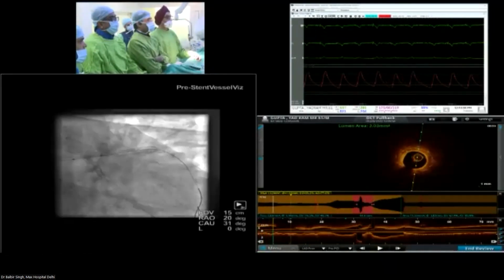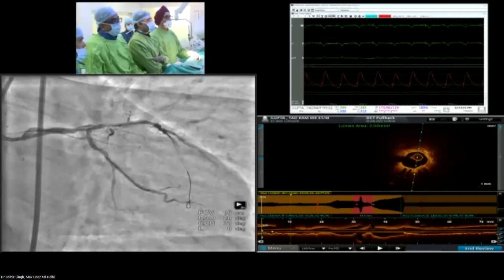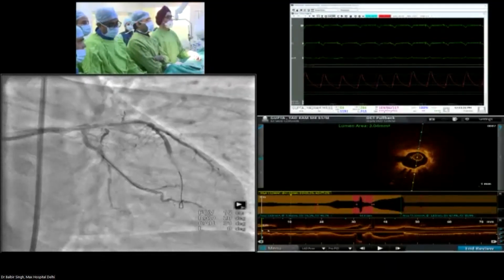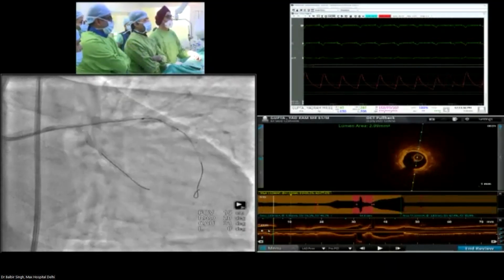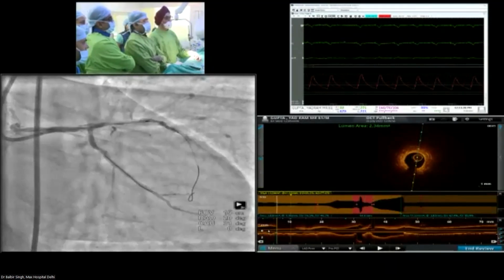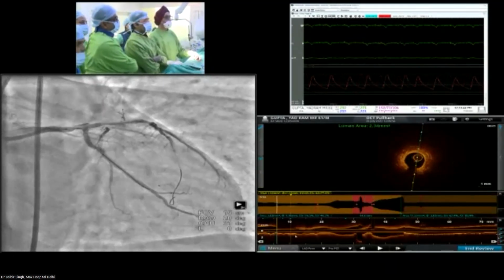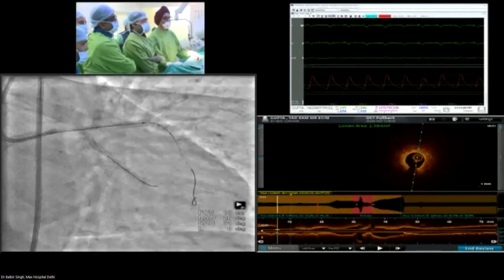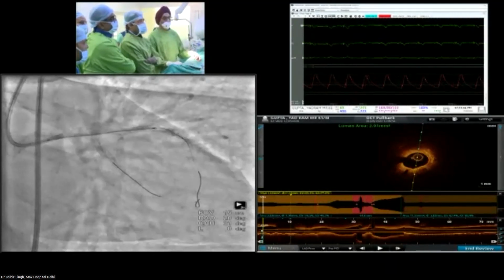Next. After this dilatation, next. You see this is the OCT catheter in. There was a dissection. We knew even before putting the catheter, there was a dissection in the LAD ostium and the left main. Clearly visible with just a 3 millimeter balloon at 4 atmospheres pressure, indicating how vulnerable this plaque is. And this is one OCT and then an IVUS. Both images have been done. We'll go straight to the imaging part before we go on to the discussion.